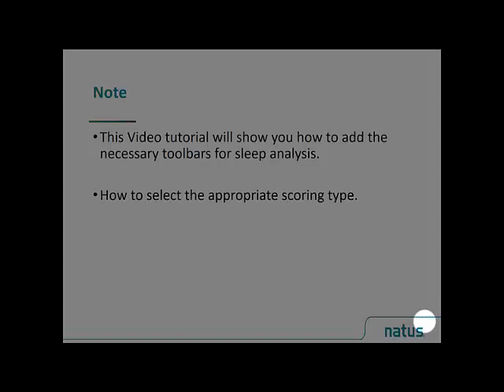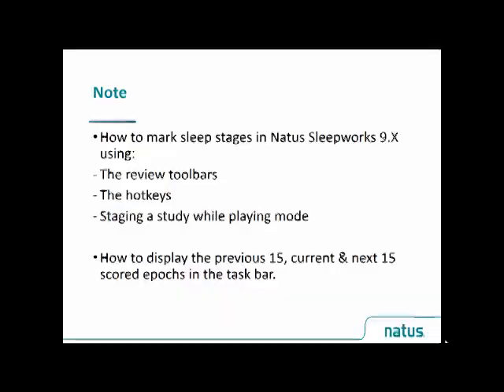This video tutorial will show you how to add the necessary toolbars for sleep analysis. You will learn how to select the appropriate scoring type.